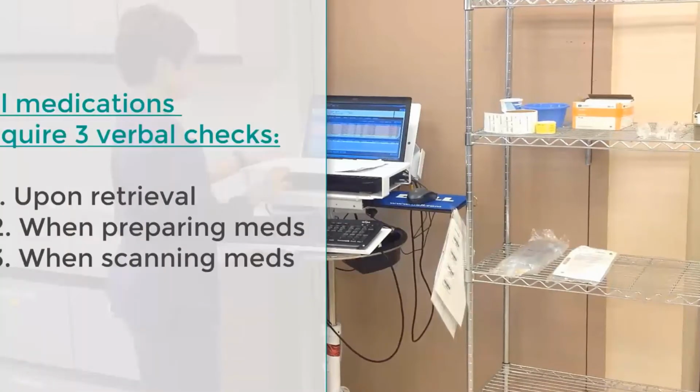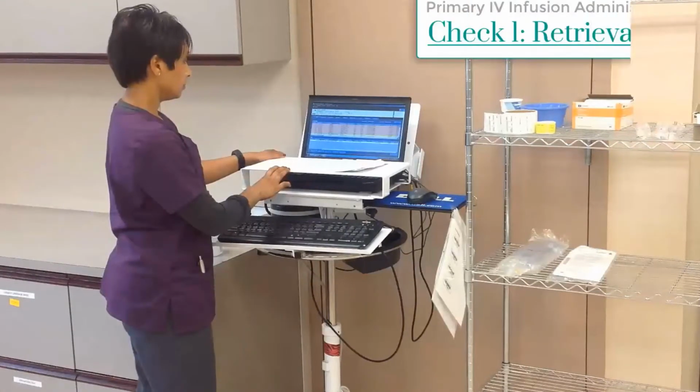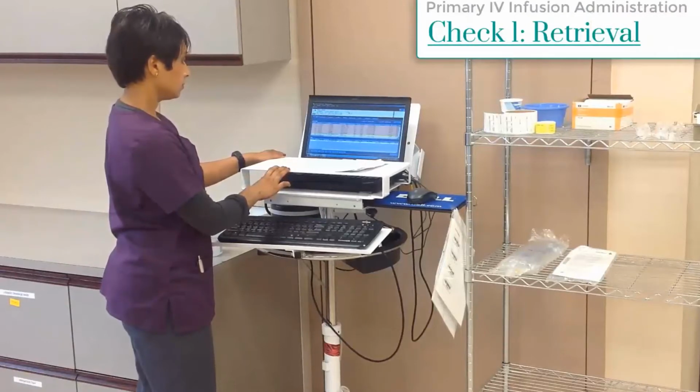All medications require 3 verbal checks, first upon retrieval, second when preparing, and third when we scan the meds. You are expected to verbalize all 3 checks out loud. Check 1 is retrieval. You will begin this validation in the med room.